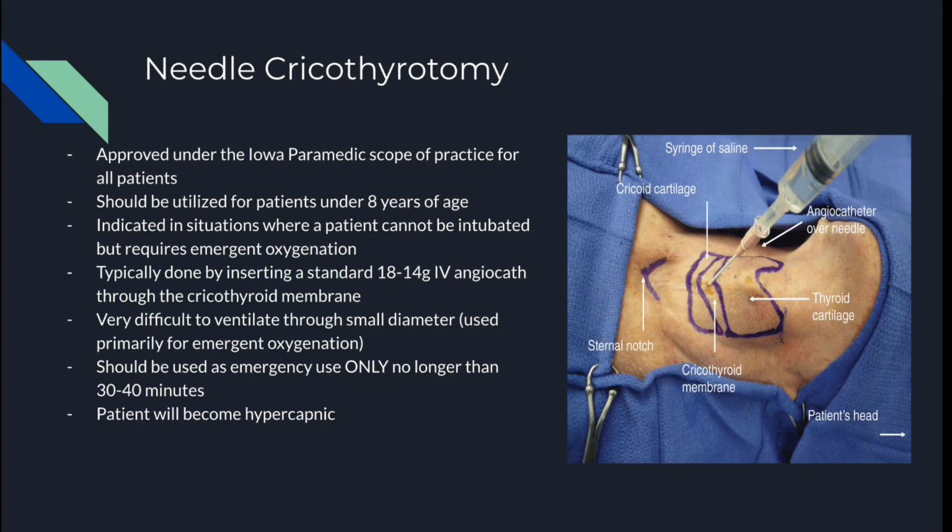It's going to be exceedingly difficult to ventilate the patient. And that's why setting up jet insufflator type of devices, and in the video here later they'll show you a method on how to make one of those, is going to be very beneficial. So this is really going to be a means of oxygenating the patient, not ventilating.